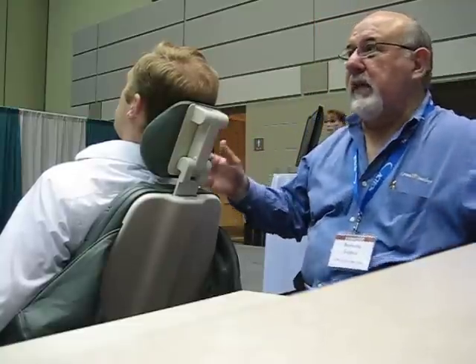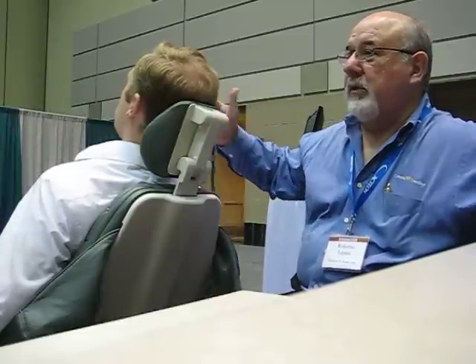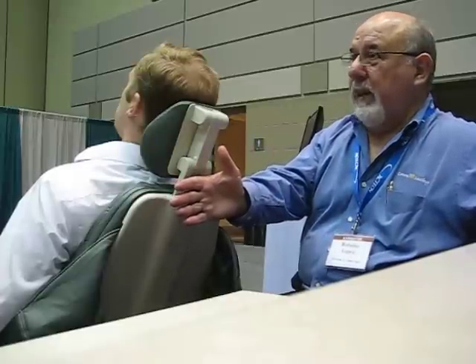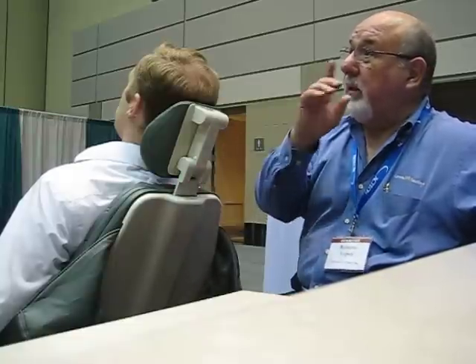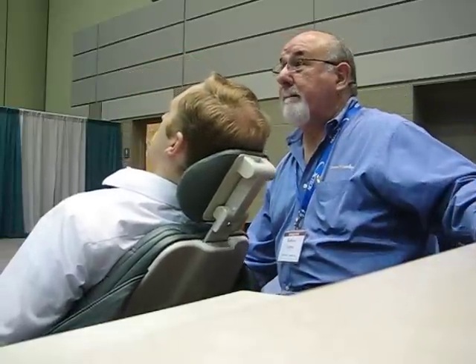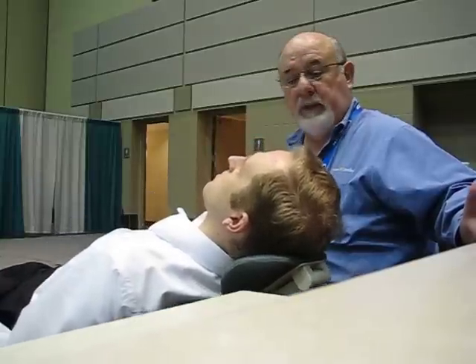So right now, when you design a treatment room, you design your treatment room 11 feet long, with a 2-foot rear support, and then when you design, you leave 18 to 24 inches here, correct? All right. Now, if you make a mistake, then it makes it more difficult for a doctor to get to 12 o'clock or to work. But the other thing is, you're making that decision of the 24 inches based on when the chair is all the way back, correct? All right.